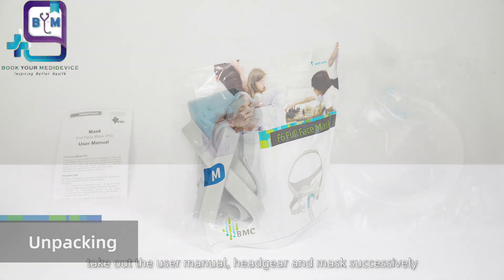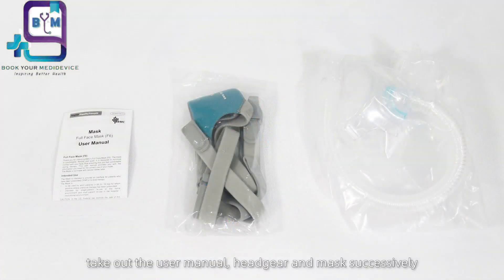Open the mask package and take out the user manual, headgear, and mask successively.